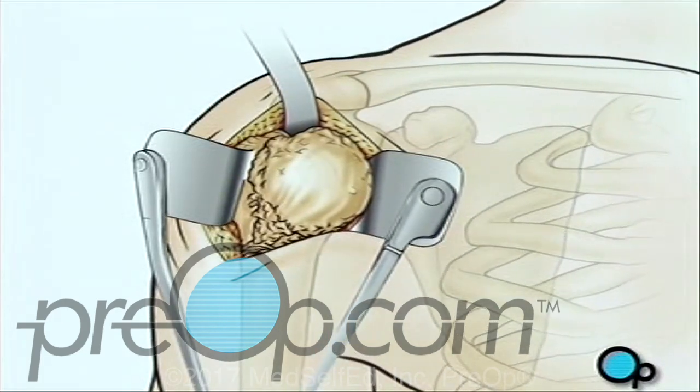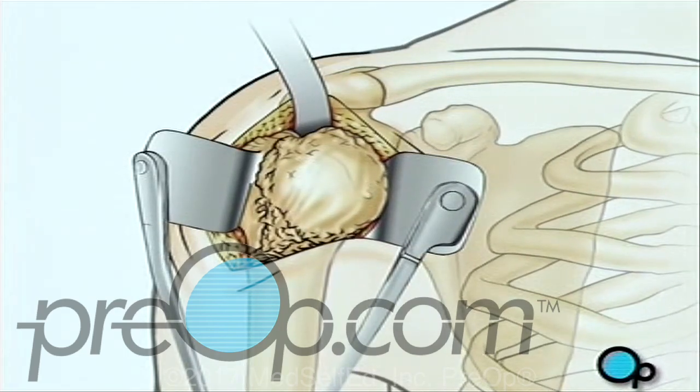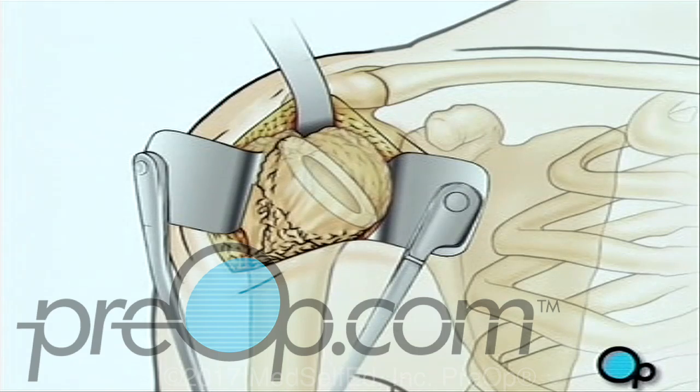Next, the team pulls the top of the arm bone out of the shoulder socket. Using a precision surgical saw, your doctor will carefully remove the ball-shaped end of the upper arm.